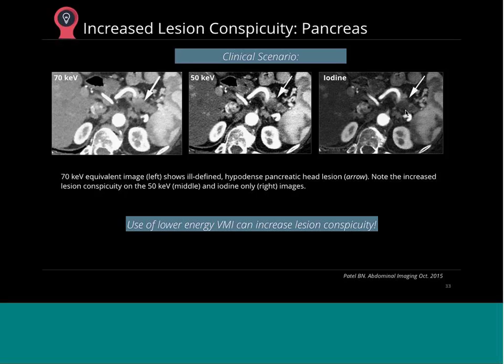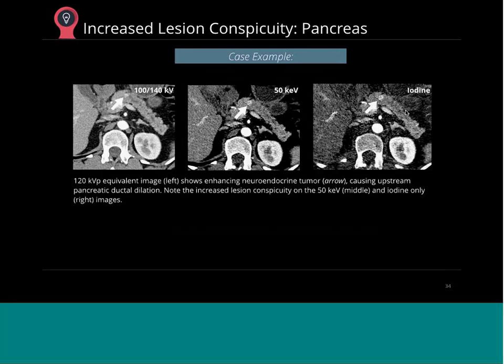But if we can stage the tumor appropriately, which dual energy CT would allow you to do because you can see it better, then those patients don't undergo unnecessary exams. You can say the same thing about hypervascular lesion. Here's a lesion that's brighter than the background pancreatic parenchyma. Yes, you can see it here, but look how much more accentuated. This thing is like 4 or 5 millimeters.